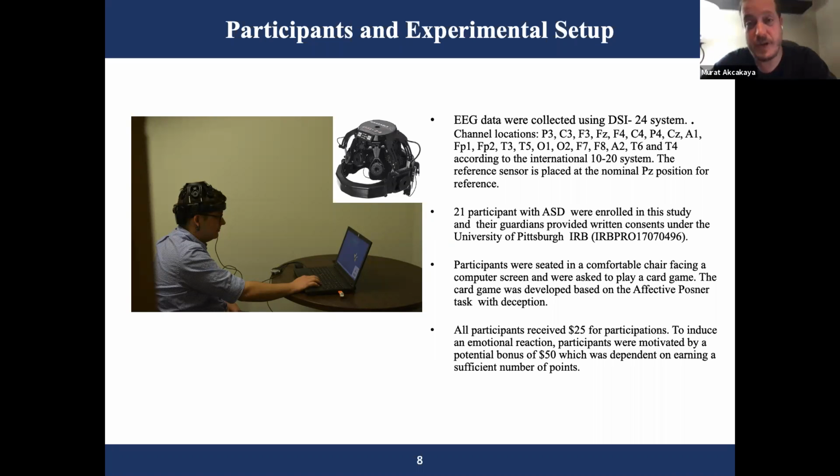So these are all good questions. At this point, I think the initial step, even though we envision this system to be going outside the lab environment, is that we need to first show that everything works in a lab environment with the target population. The lab that you see is where we do our work and where we get our participants. Right now, the participants that we have are verbal participants in the autism spectrum. But the severity of the spectrum might or might not affect the usability of the system. We didn't investigate it yet, and that needs further investigation.